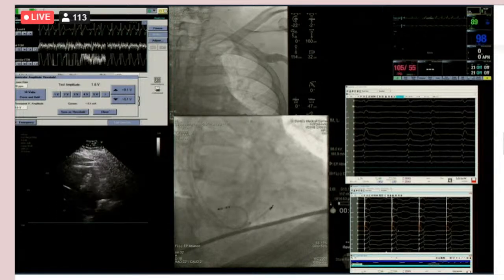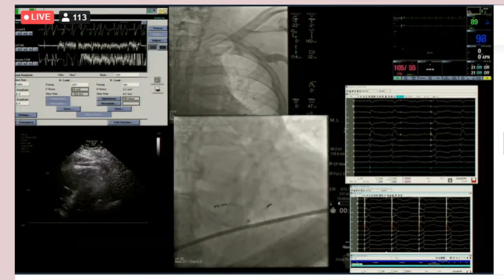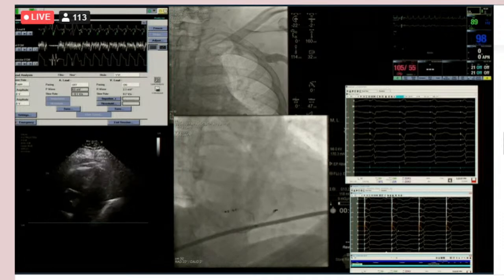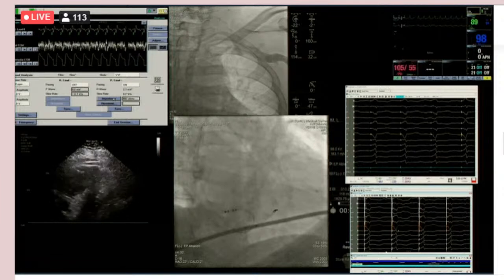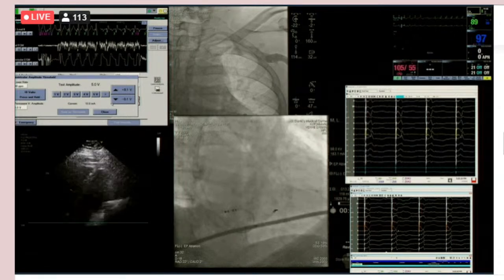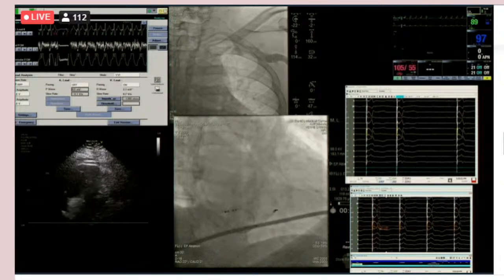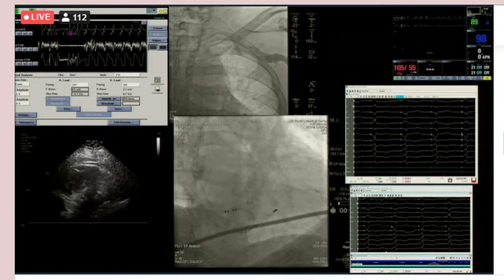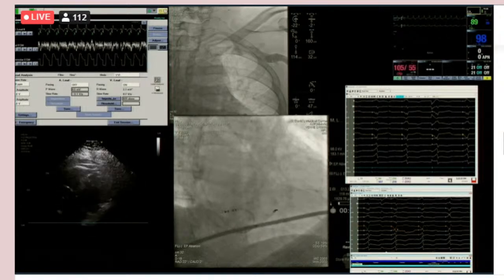So I'm going to go bipolar now. Back to 5. I do have to make sure that our proximal is extended beyond it. Okay, go ahead. Okay, it looks like you're capturing both. So that's 790, 800. So this is unipolar. So unipolar looks better than bipolar. See, that looks nice. 485, 487. And that's bipolar. Bipolar looks like we're capturing RV, basically the right side.